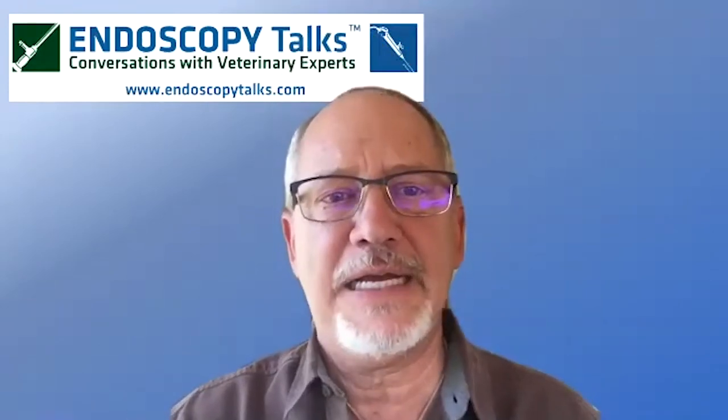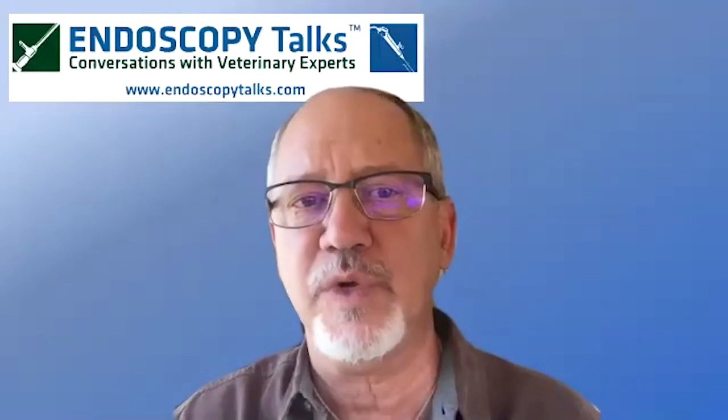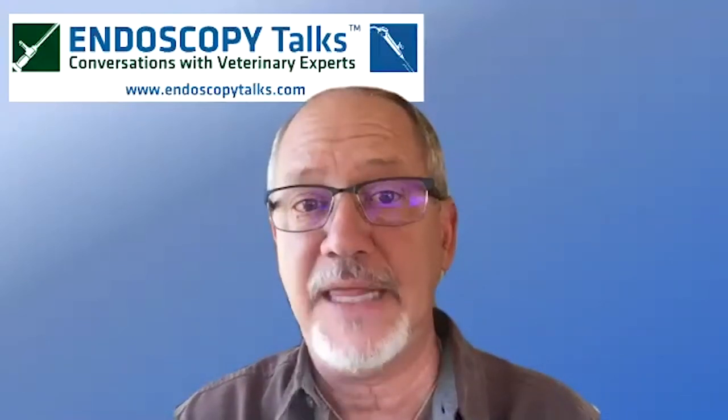And the next question is with regard to fluid ingress. Do you flush with saline? Do I need a pressure bag? Okay. So when we're doing arthroscopy, we have to have a very good image. To have a good image, you have to have fluid circulating through the joint. So we have an instrument that goes in that delivers fluid into the joint, and that's through the scope. And it's actually through the cannula that the scope sits in.